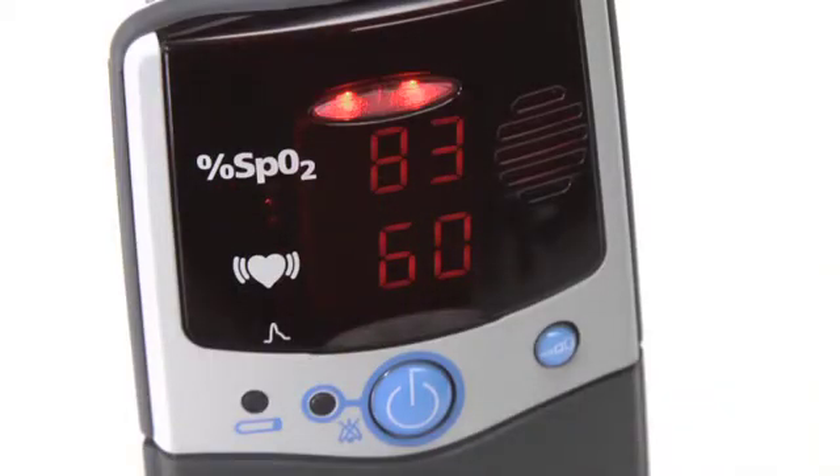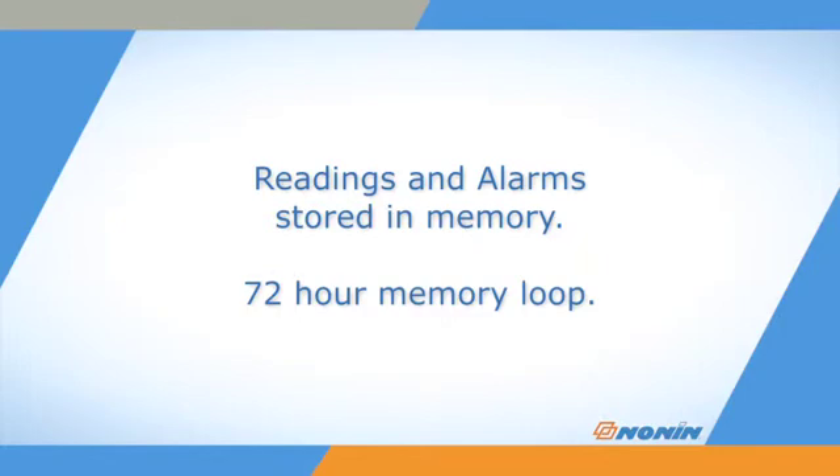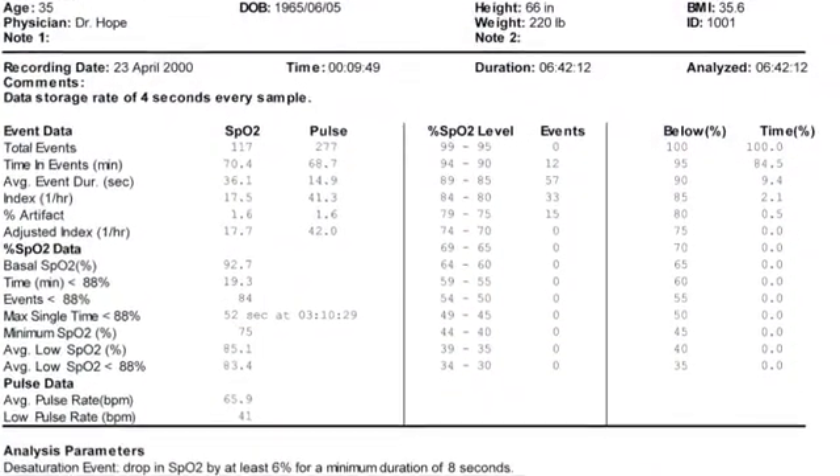The oximeter will record the time and date of any alarm in its stored data, along with regular oxygen saturation and pulse readings. The stored data is retained for the last 72 hours of use, and then records over the older data. Data can be downloaded and analyzed on Nonin Envision software.